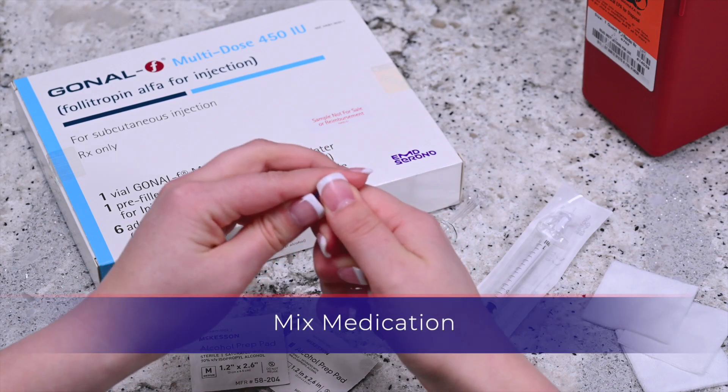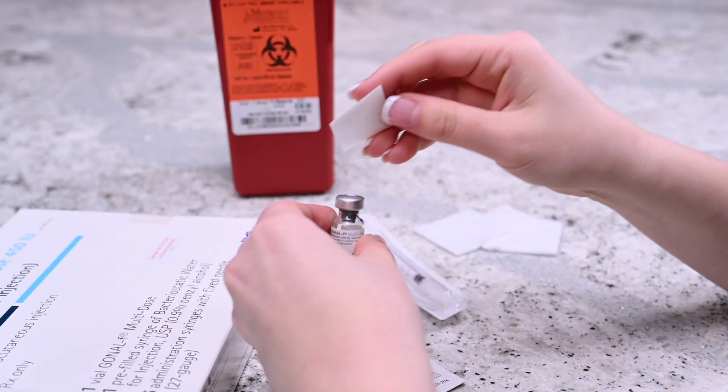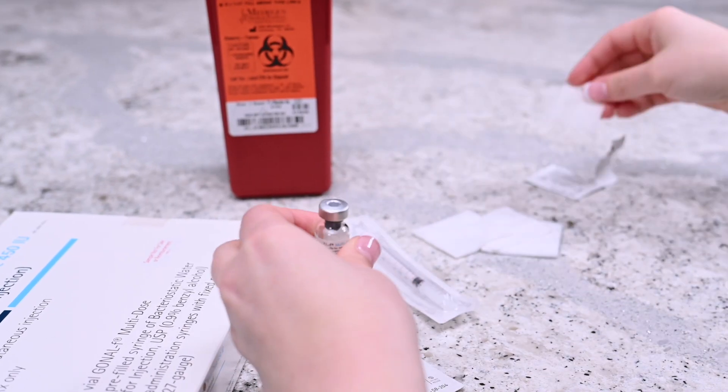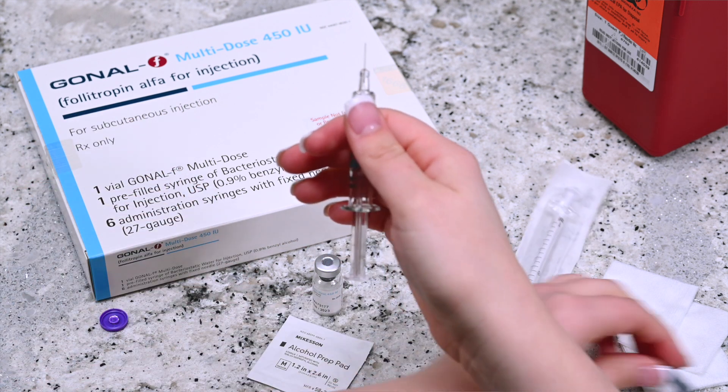The Gonal F multi-dose vial can be stored at room temperature for up to 28 days or in the refrigerator. Remove the cap from the Gonal F multi-dose vial and disinfect by wiping the top with an alcohol prep wipe. Remove the cap from the pre-filled syringe of bacteriostatic water.